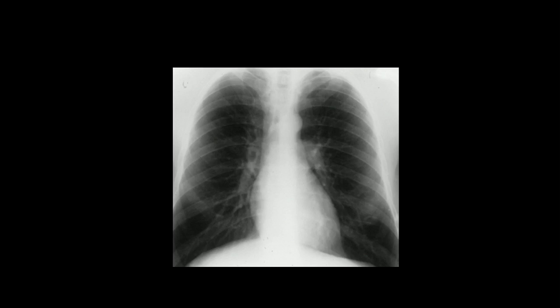Moving from that to the camera angles. I think the best way to approach the camera angles is to think about the anatomy that's represented on a 2D echo. Then apply the principle that in general we try to position the cameras perpendicular to the structure we're trying to look at, so that we avoid foreshortening or lengthening. So just visualize the anatomy when you're looking at the X-ray.